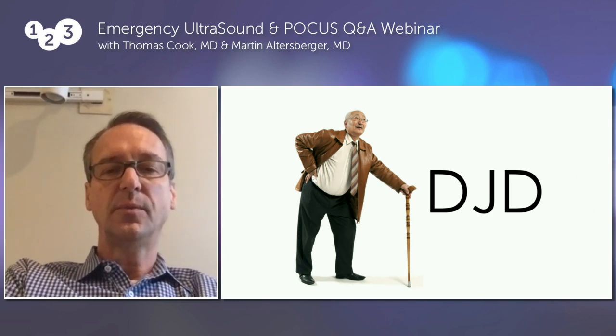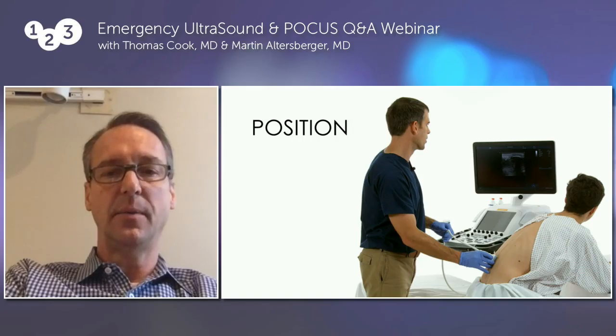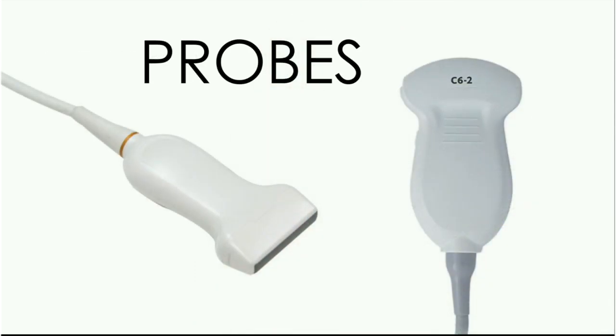But in terms of actually getting ready for the procedure, I typically have the patient sitting on the side of the bed. It makes your orientation a little bit easier to understand. And then from that, you're going to have to choose a transducer. And most people would typically reach for a linear array transducer on the left, but this will only work in your smaller or sort of normal size patients. For the larger patients, you're going to have to use that curvilinear array probe on your right to be able to get the penetration.